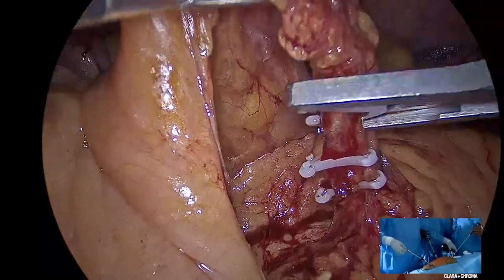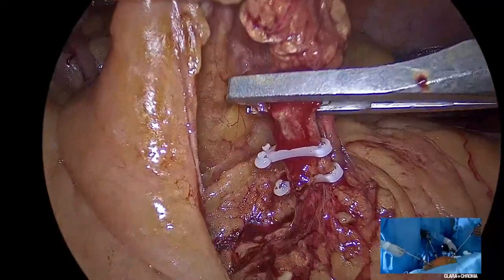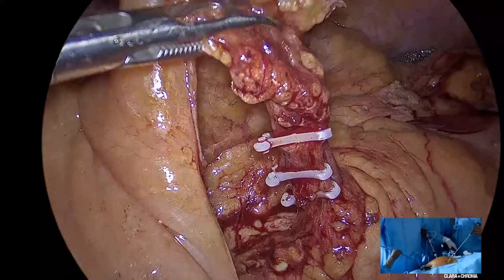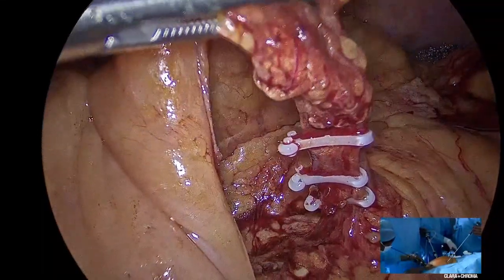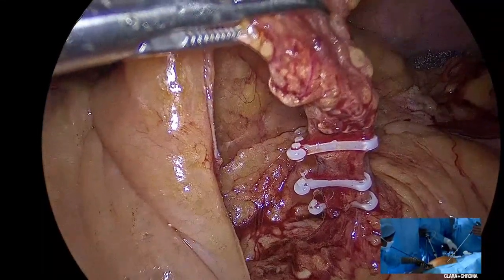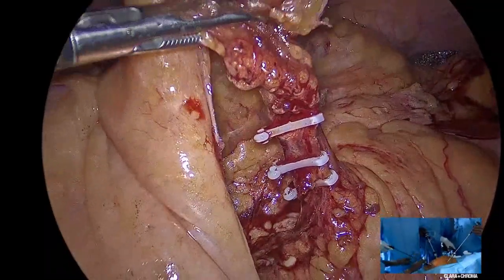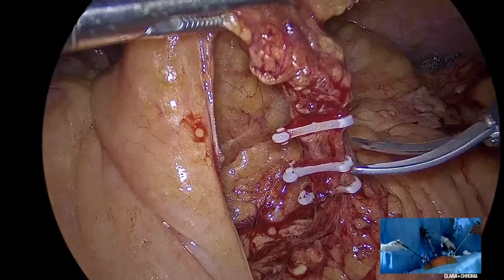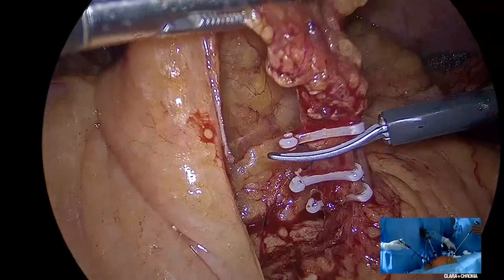100%. These are very big vessels, and the artery and the vein should be dealt with separately if you are clipping. Correct. The stapler separates them out. Correct. And the other small tip for the juniors in the audience, when you have used a plastic material like this to ligate a vessel, do not use an energy device to cut. Always use the scissors to cut.